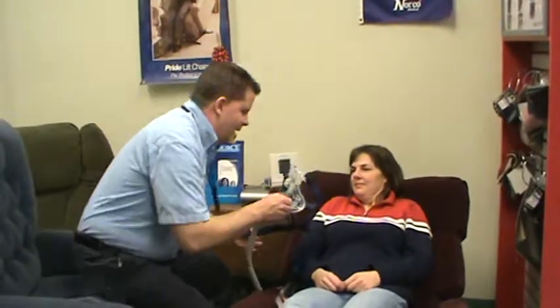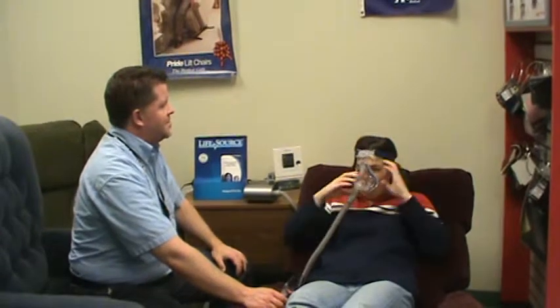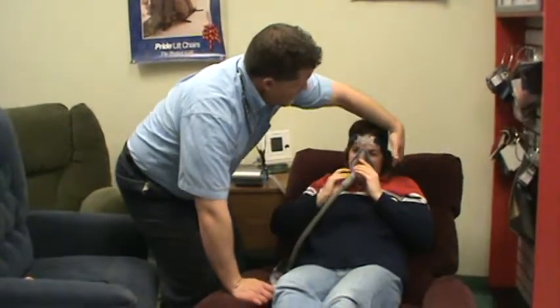Why don't you go ahead and place the mask on your face. I'll help you a little bit because I know you have a loving husband who will help you at night.